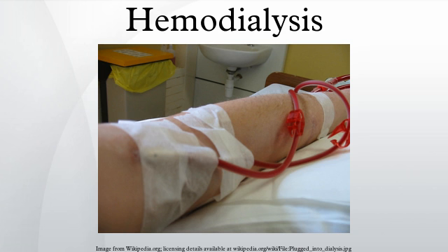Finally, there is growing interest in short daily home hemodialysis, which is 1.5 to 4 hour sessions given 5 to 7 times per week, usually at home. There also is interest in nocturnal dialysis, which involves dialyzing a patient, usually at home, for 8 to 10 hours per night, 3 to 6 nights per week. Nocturnal in-center dialysis, 3 to 4 times per week, is also offered at a handful of dialysis units in the United States. Side effects and complications.